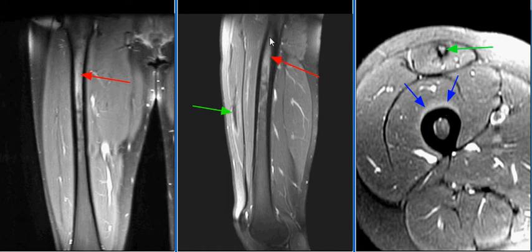Associated marrow edema is seen in the proximal shaft of the femur, as seen on this image with the red arrow. No discrete fracture is identified.